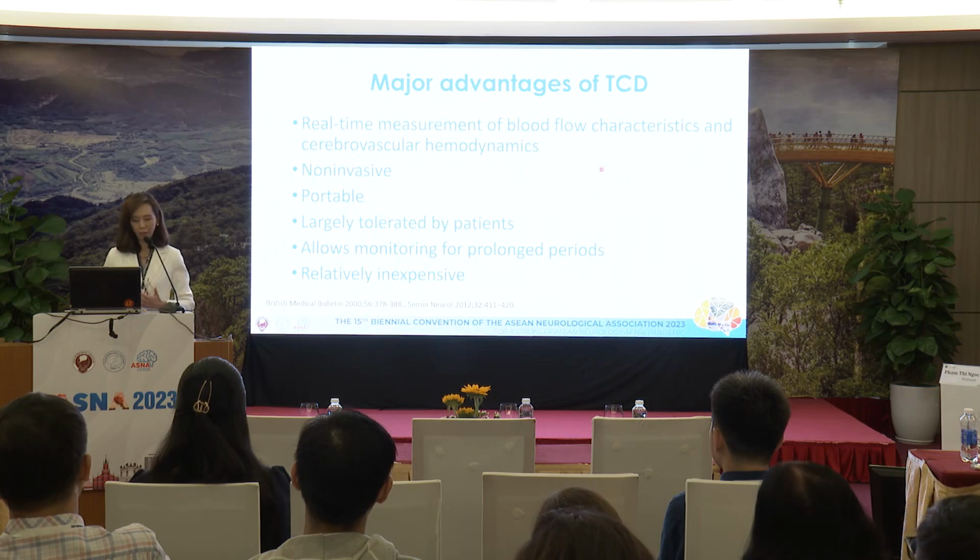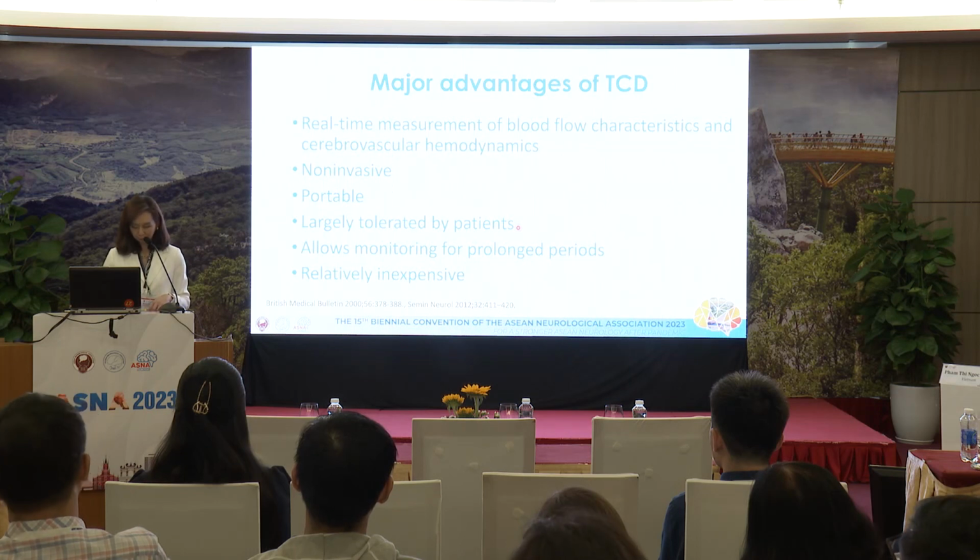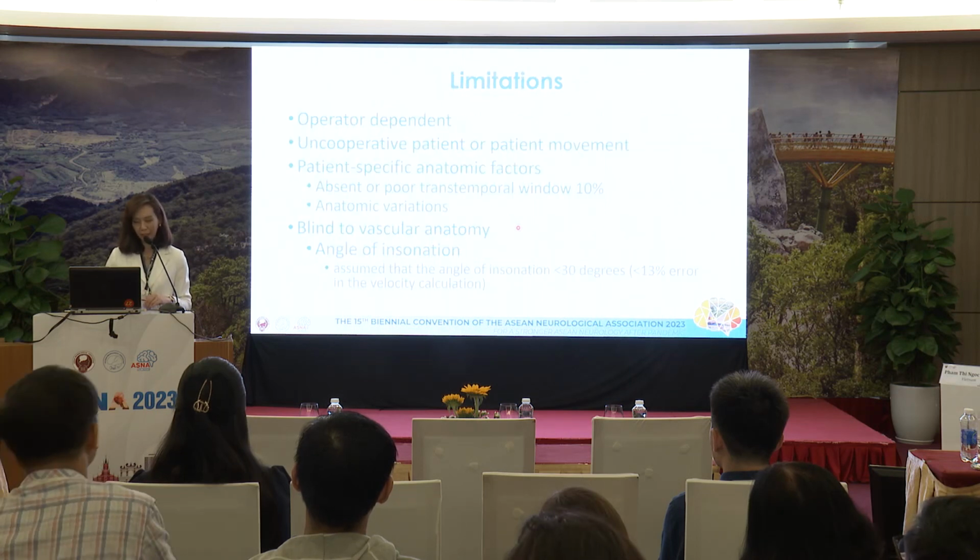We're not using any harmful things, and it's portable, as mentioned earlier. We can move it around. I think it's very highly tolerated by patients. You can just put the probe in, and it's no harm or anything. It's not painful, so it's tolerable, and relatively it's inexpensive.